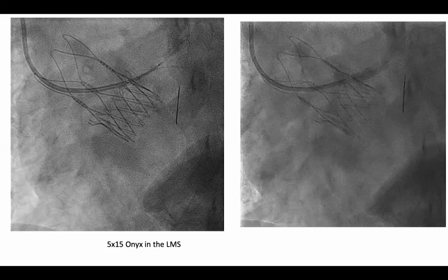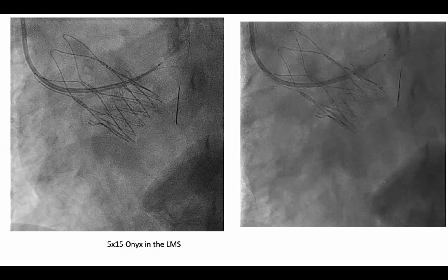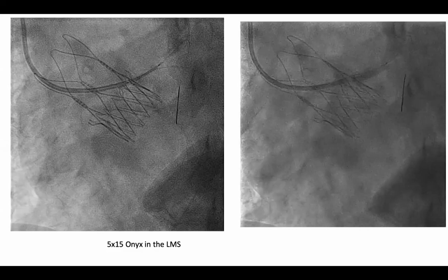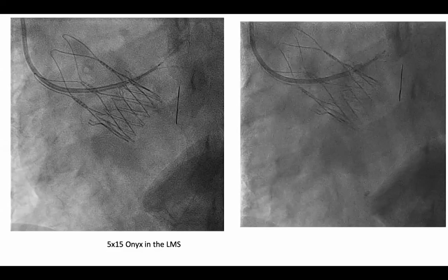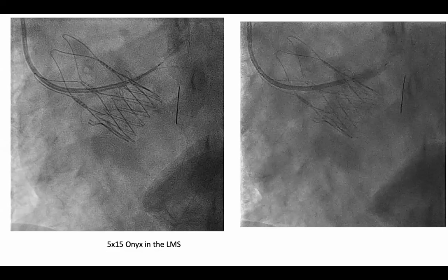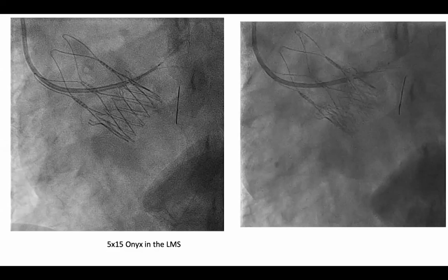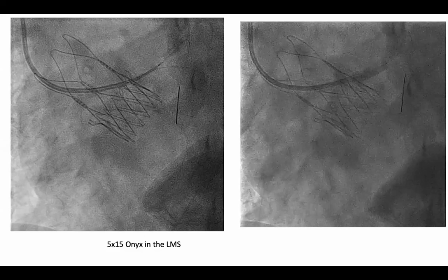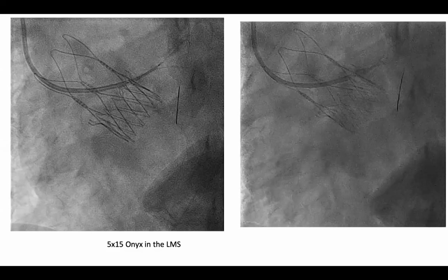What I normally do is put in a guide catheter extension, especially if it's not a bifurcation, so you can engage it, wire it, and have a guide catheter extension like GuideLiner, and it gives you fantastic access to the artery without interaction with the TAVI valve struts.